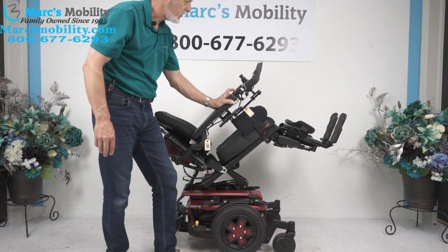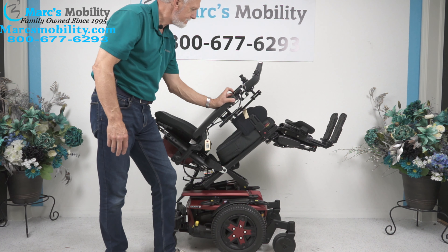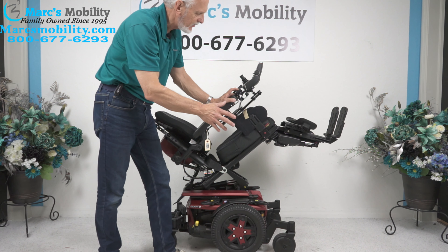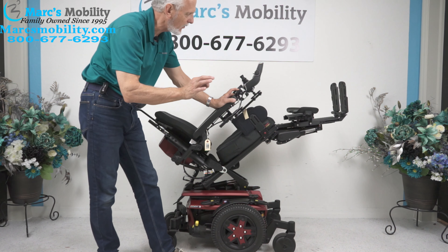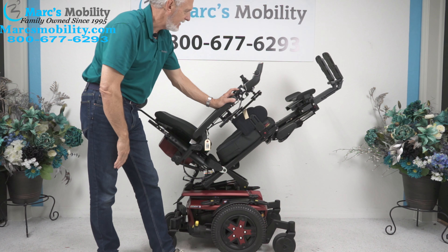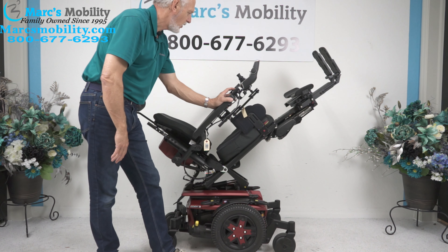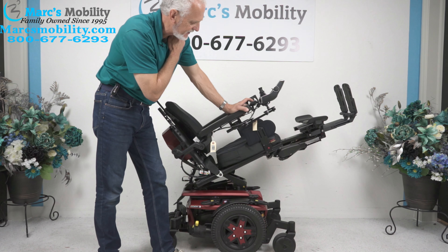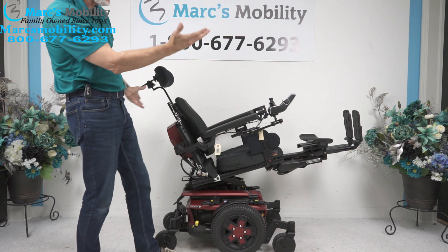The next function I'm going to share is called the electric legs. They can go down or up. So if you need some good circulation, you could raise those legs up and you would have tremendous circulation. I'm showing you from the most extreme tilted back and legs up position. But if we bring the seat back down halfway, you'll see that even if you're halfway tilted, you'd still have some good circulation — you can see your legs are higher than your body.